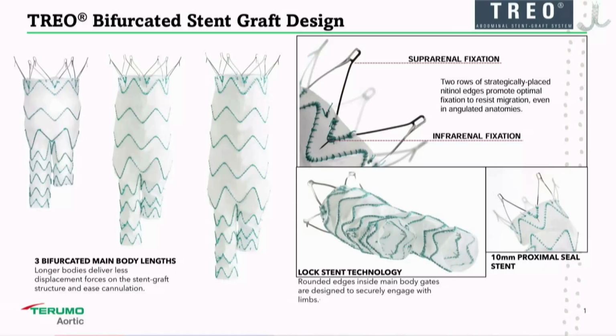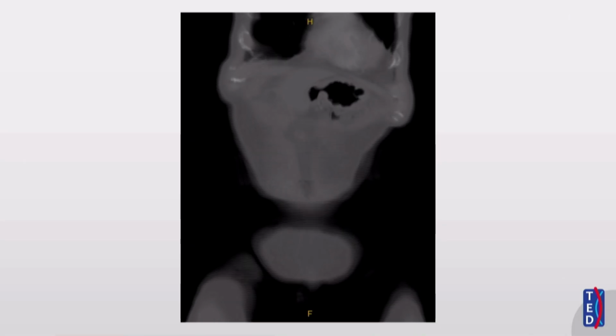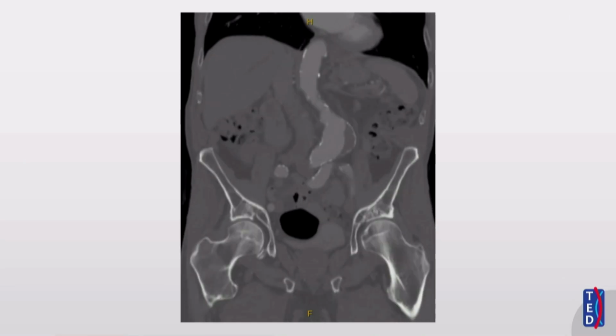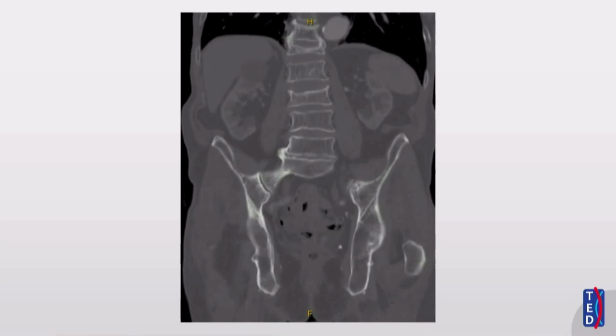Anyway, the aneurysm. Okay, play that. Let me see if that shows it well. Initially, he was, go back. Can you play that? Continue to play it? Yeah, keep going slow, slow, slow. Here you go. So it's very tortuous.